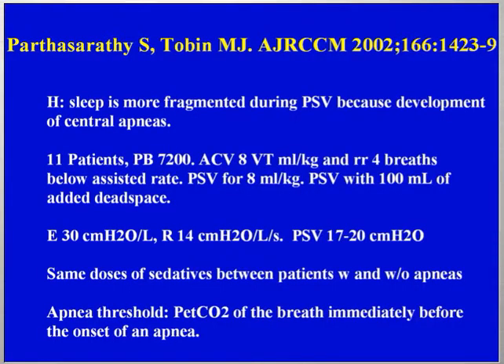Another aspect related with pressure support ventilation is the sleep issue, which was alluded to by previous speakers in the session that we had before. And in this investigation by Parthasarathy and his co-workers, the authors hypothesized that sleep is more fragmented during pressure support ventilation because of the development of central apneas.